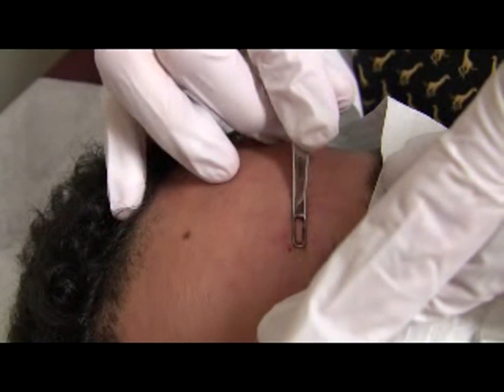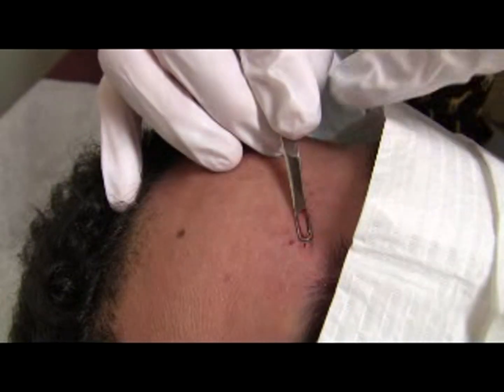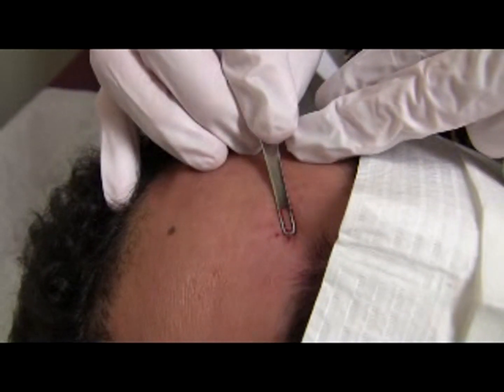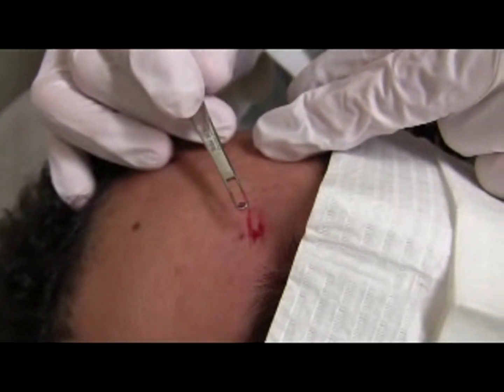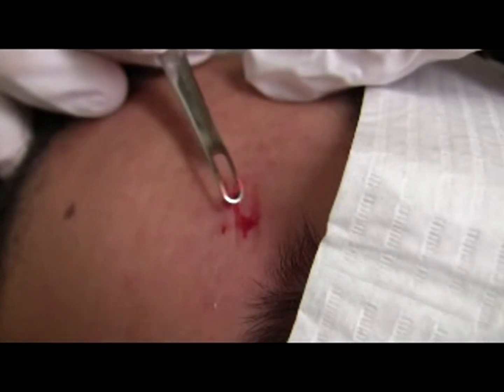We got it. The comedone contents should gradually but steadily exit from the incision you made. You can see it on the gauze better.